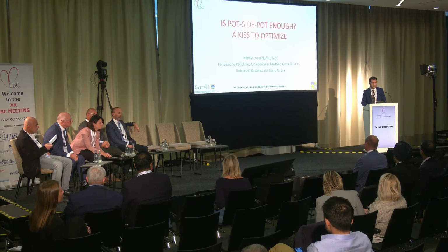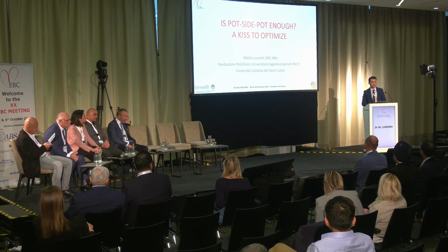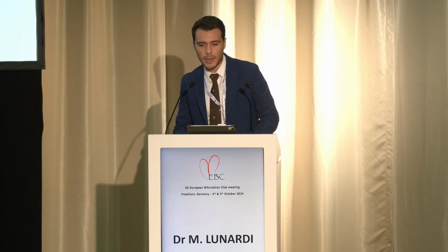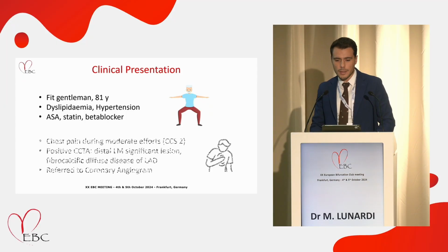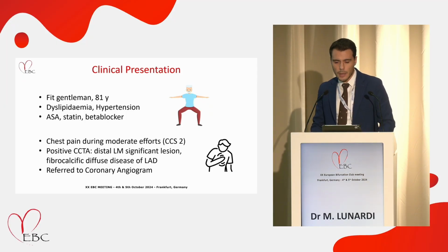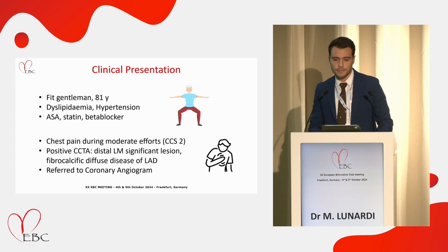Well, this is a very illustrative case of the difference between these 2 ballooning techniques after provisional stenting. We are talking about an 81-year-old gentleman, quite fit with few comorbidities, who was referred for CCTA because of effort chest pain, which revealed a significant distal left main stenosis involving the bifurcation, followed by fibrocalcific diffuse disease of the LAD. This is the reason why he was referred to our cath lab.